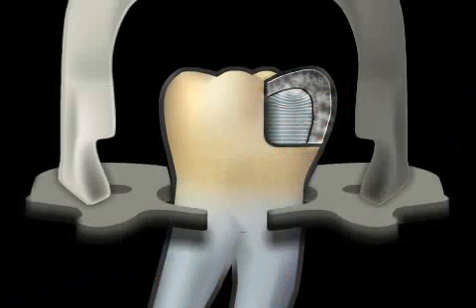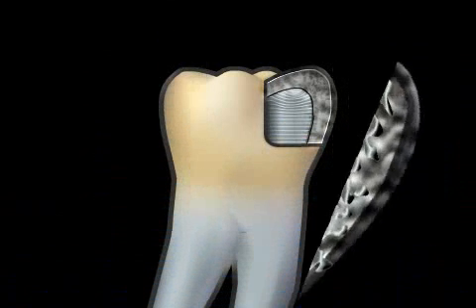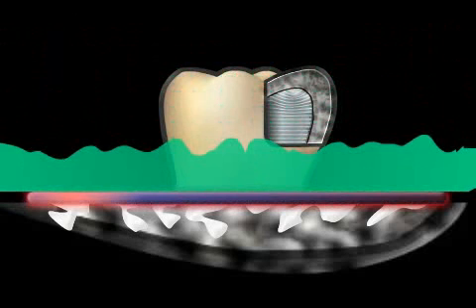Good results are only possible if the tooth remains clean. A cofferdam should always be used. The animation shows what happens if, for example, saliva, shown in red, gets on the tooth. The porous surface closes, and the glue, shown in green, can no longer flow in.